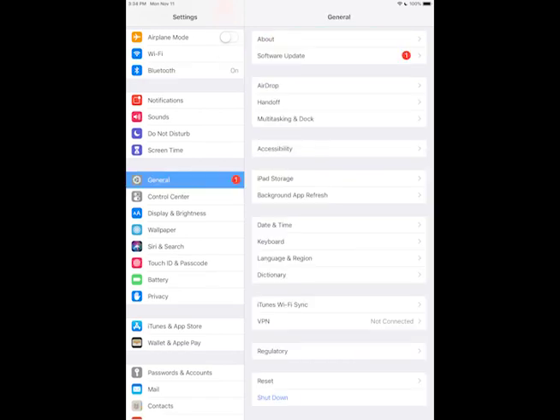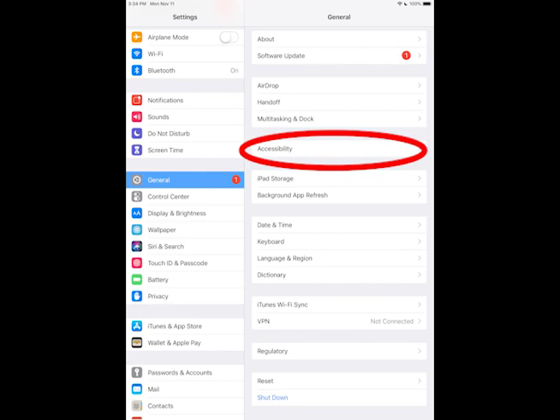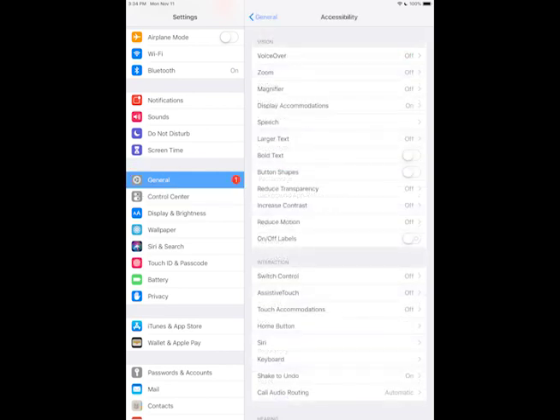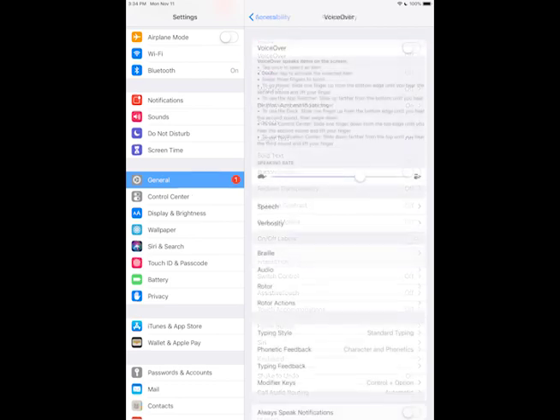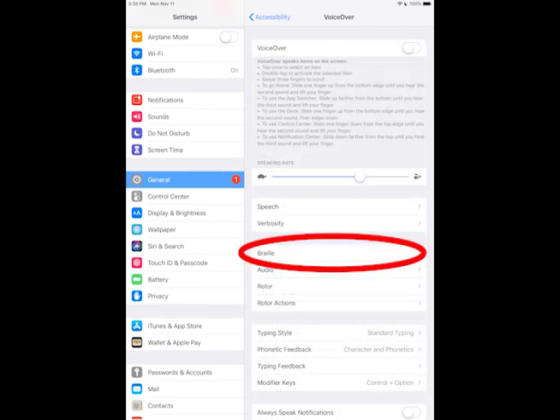Now go back to the Settings page and select Accessibility. Depending on your iOS version, the Accessibility menu may be found under the main page or under General. In the Accessibility menu, select VoiceOver and then Braille.